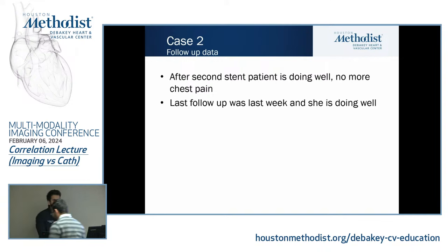So in this situation, most likely the ischemia in the LAD territory is coming from the unrevascularized D1, plus it could be from maybe proximal disease. Now, should you go after it, or how much of the OM was giving collaterals to that segment. If she's having no symptoms, I mean, we're done, so we don't need to keep testing. Like along the CTO, it was not cutting all the way back.